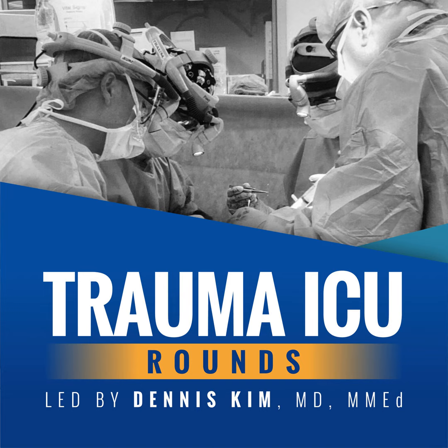One of the major issues with intermittent mandatory ventilation, or IMV, is the potential for a problem known as breath stacking, which may occur when a machine-triggered or mandatory breath is delivered at the exact same time that a patient initiates a spontaneous breath. When this happens, patients may receive an inordinately large breath, which has the potential to induce barotrauma. And this is usually circumvented by setting a peak pressure limit.